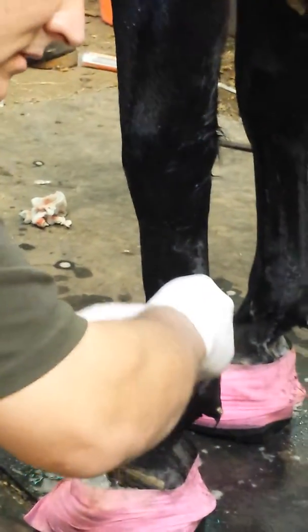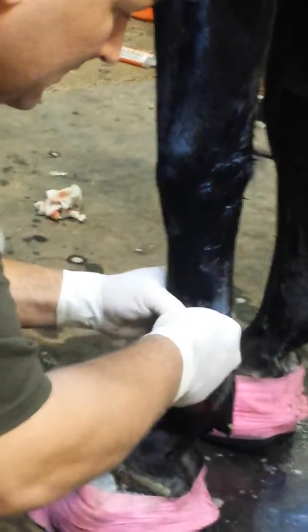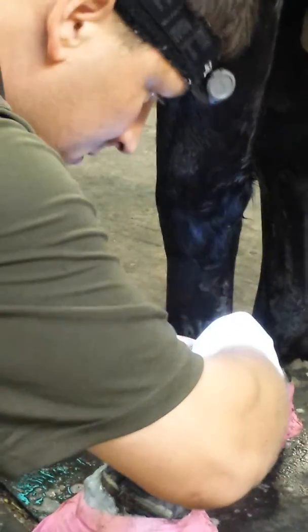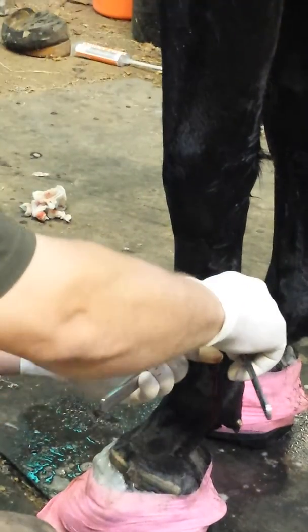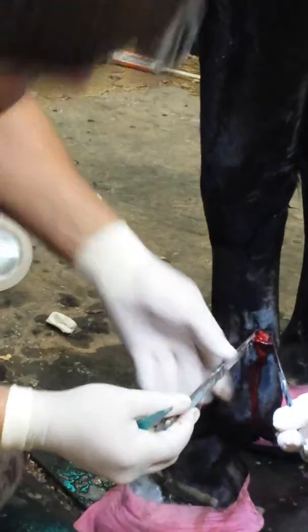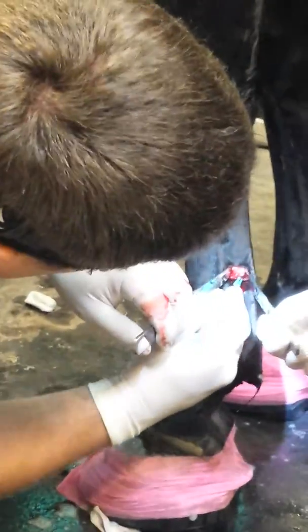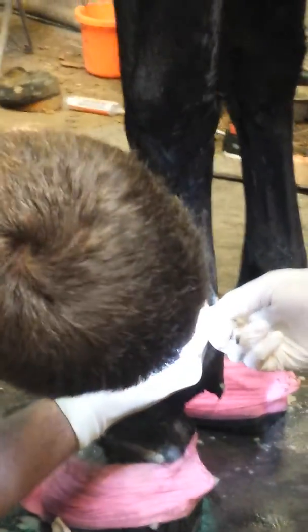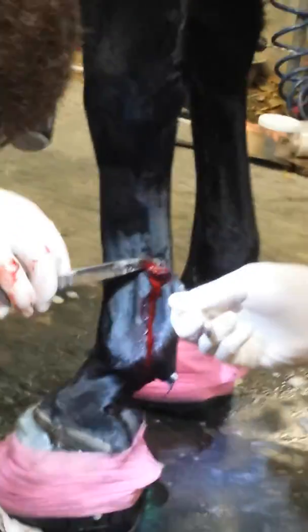I want to be sure you can feel that your retractors are touching on the opposite side. I'll work them back and forth and make sure that I'm on the retractors themselves. I'm going to have your assistant hold the edge of that. Be sure to stay nice and low — you can see the tendon in there, so all we have in there is a tendon. Cut down into your retractors. There we have our tendon; go ahead and pull yours out.